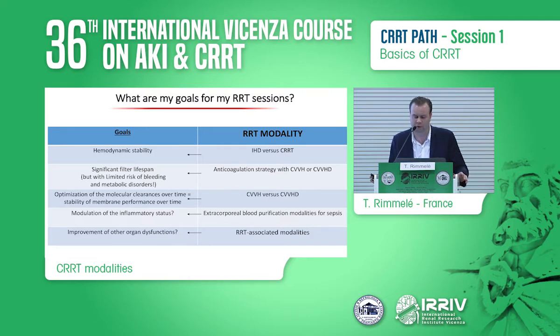For the optimization of the solute clearances, again, we can talk about the difference between CVVH and CVVHD. For the modulation of the inflammatory response, we now have a lot of extracorporeal blood purification modalities on the market. I will not talk about this today because it will be treated in other talks during this Congress. And if you want to improve other organ dysfunctions, you can now do it with renal replacement therapy associated modalities that Claudio mentioned with the most concept.